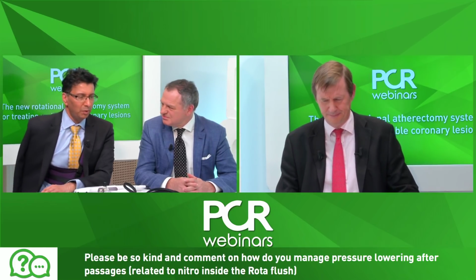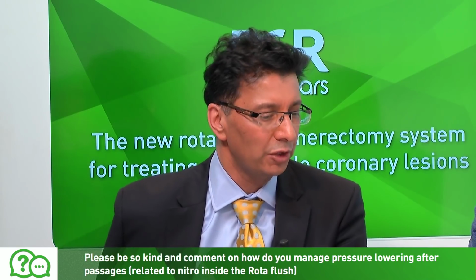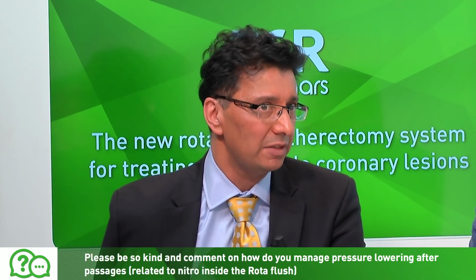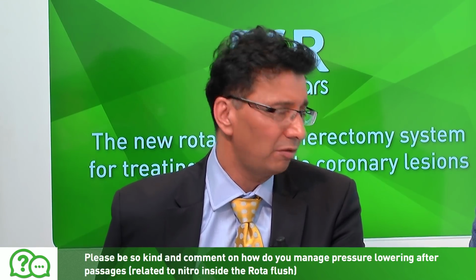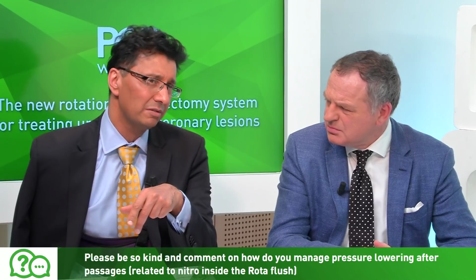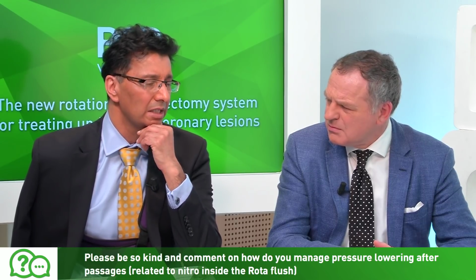Yeah, I think it's a point that it does happen sometimes. I always pressurise the cocktail to 300 millimetres mercury, and that will generate a drip speed normally of about 7 mils a minute. And some people reduce the speed of the drip rate, and that can reduce your hypotensive effects, because certainly some people will be susceptible systemically to hypotension from the verapamil and the nitrate. So if that is the case, then obviously keeping the patient hydrated is important. Boluses of phenylephrine to bolster blood pressure without affecting heart rate.